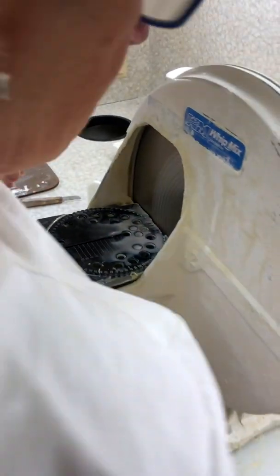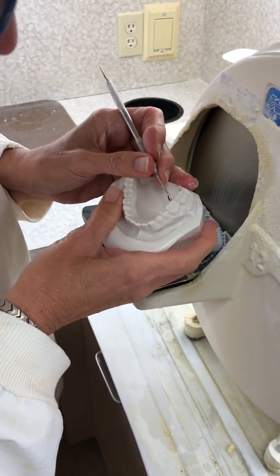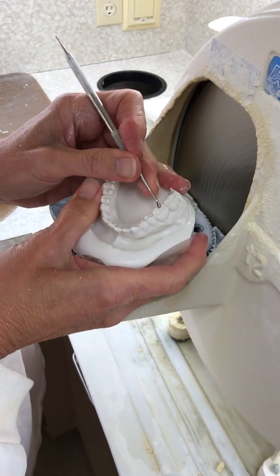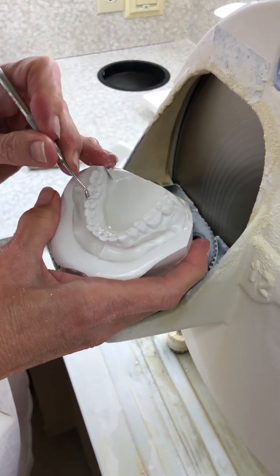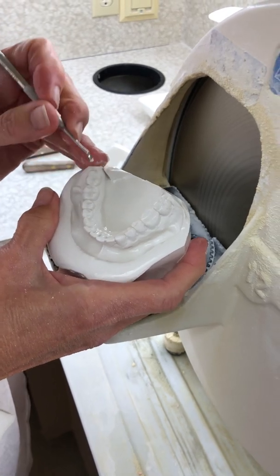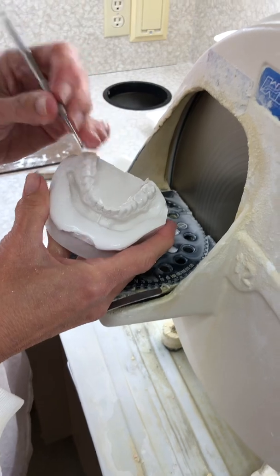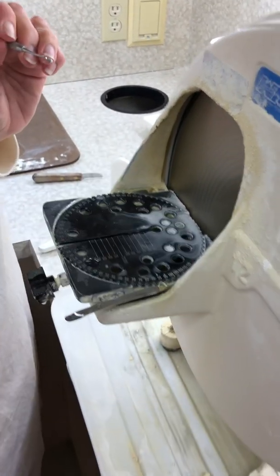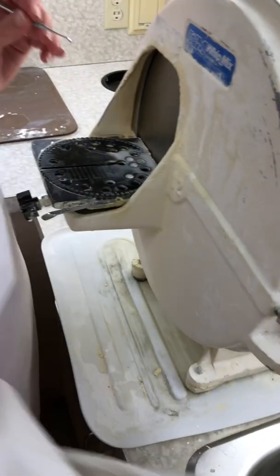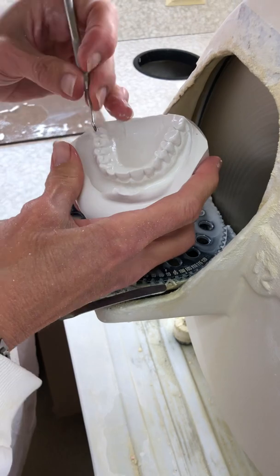The other thing that you'll want to do is basically look on the top of the model. There's a little bubble there. Pick it off unless you know that it is actually part of the anatomy of your tooth. All right? And again, that's just basically to make sure that you're not going to interfere with your bite with the wax. So I'm going to grab the top one. We're going to do the same thing with that as well. This one actually looks pretty good. A little bit right there.